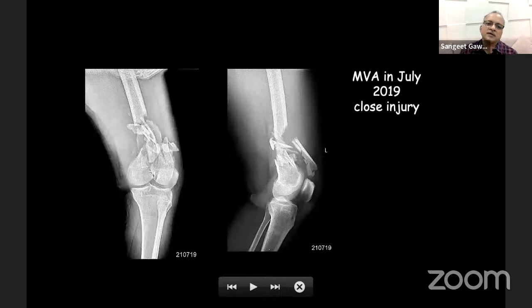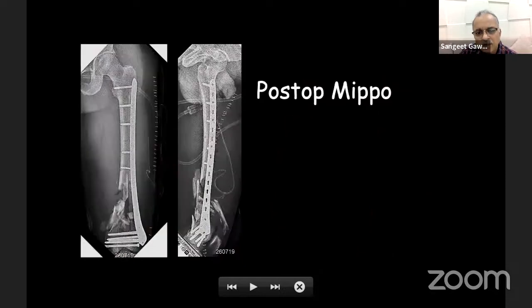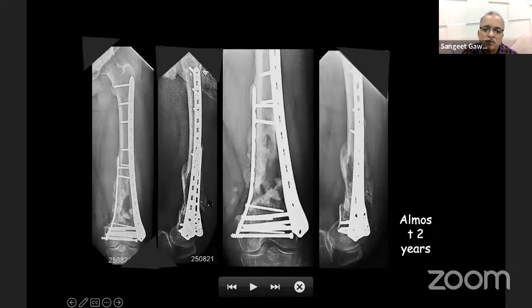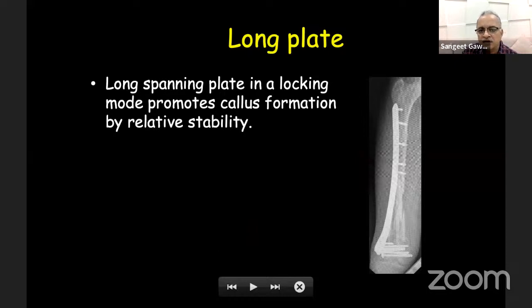So we have to be very careful in making a decision on what is a suitable implant, whether a nail or a plate. Here is a case which had an extensive comminution, and a single plate has been used right from the lesser trochanter, and nothing was done medially. So subsequently at 6 weeks, we had to add a second adjuvant plate like this and graft. So this is a rigid fixation, and that takes a long time to consolidate. That is the function of that patient. He doesn't have a complete function.